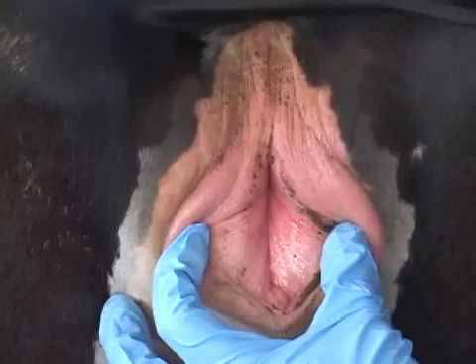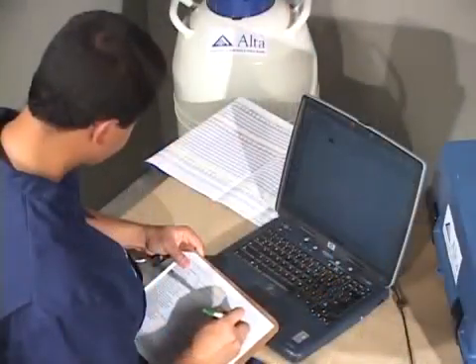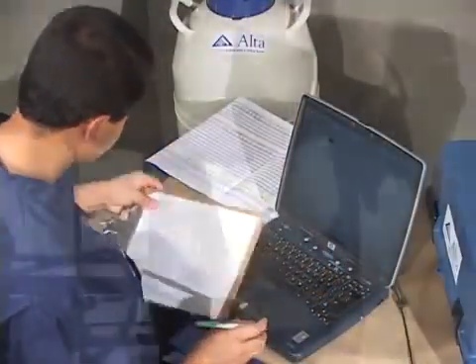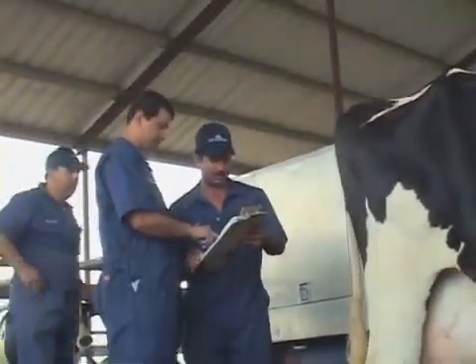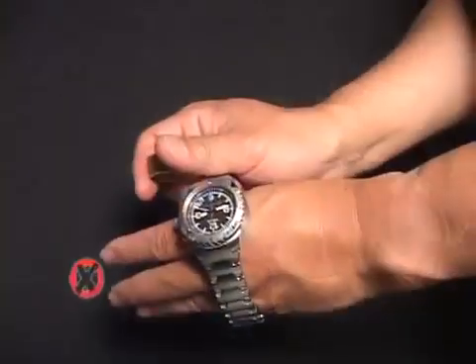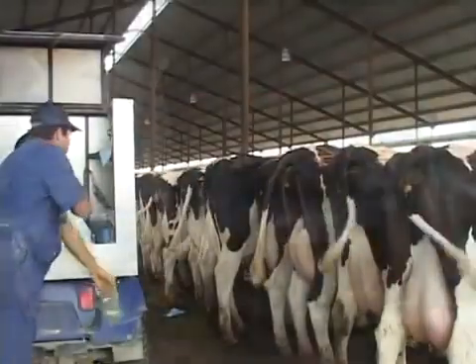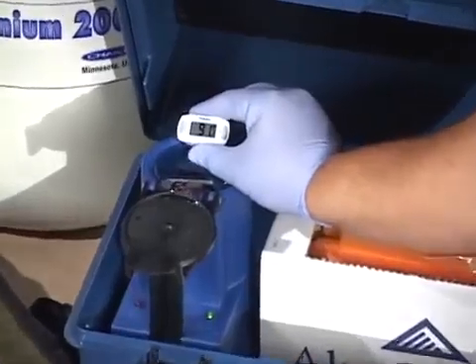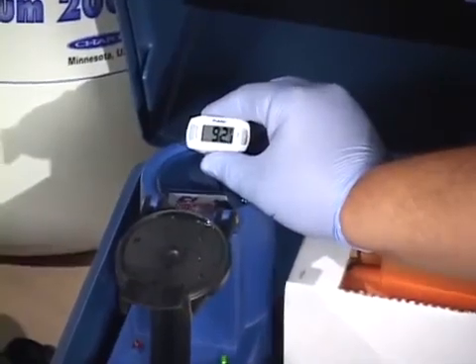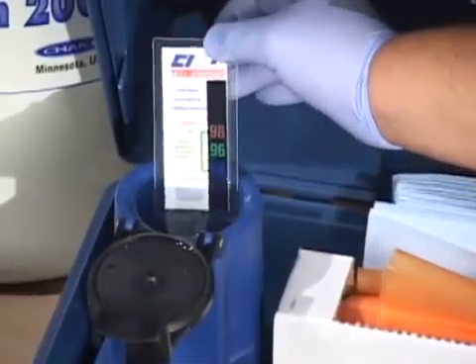Once you are sure that the cow to be bred is not pregnant and is in heat, check the identification number and the breeding records. For appropriate semen handling and to facilitate the AI gun preparation, it is advisable to keep the AI kit close to the storage tank and proceed as follows.